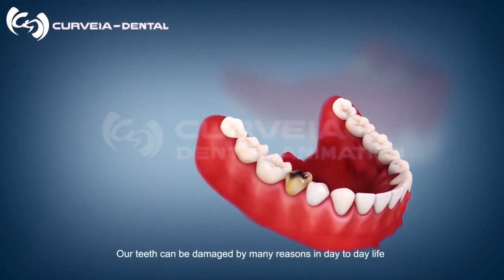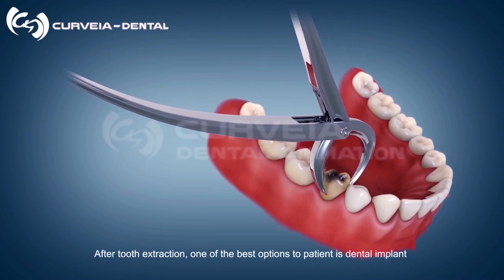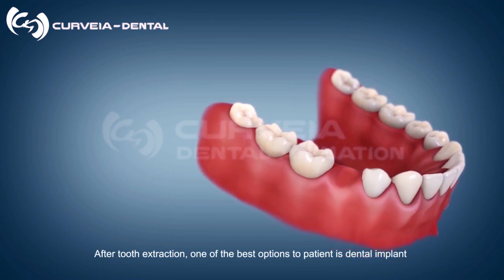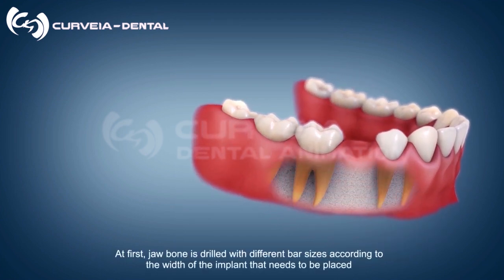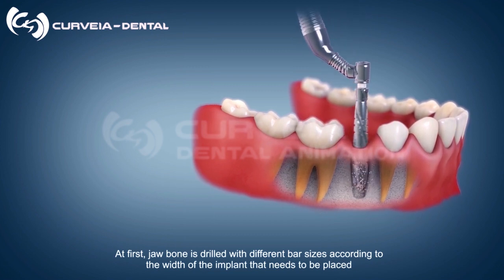Our teeth can be damaged for many reasons in day-to-day life. After tooth extraction, one of the best options for a patient is a dental implant. First, the jawbone is drilled with different bur sizes according to the width of the implant that needs to be placed.